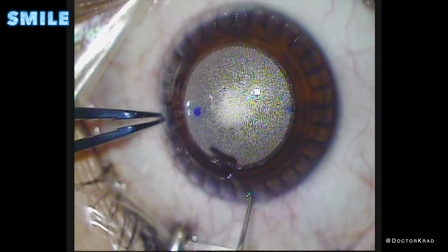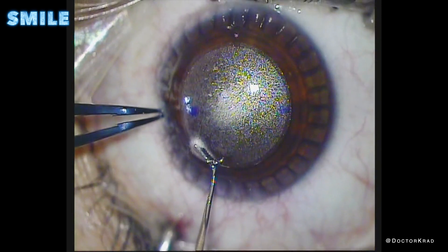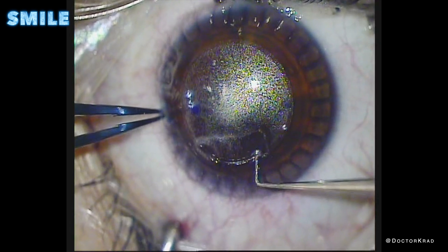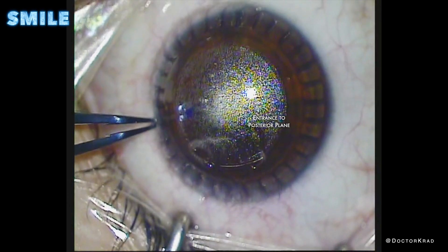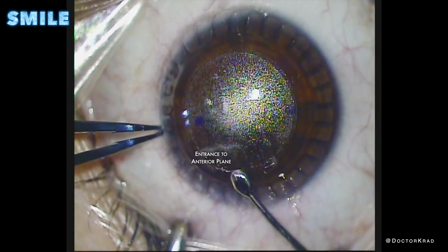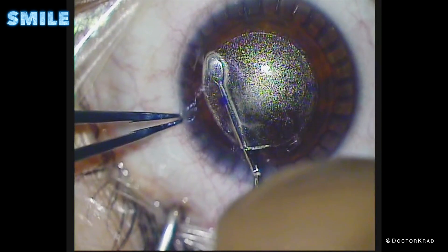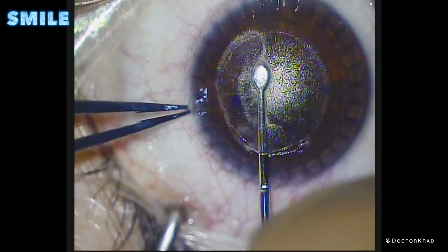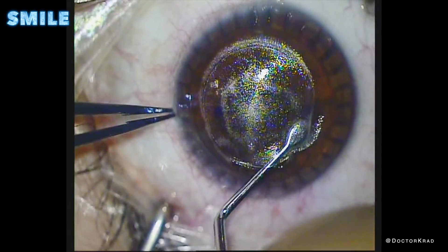During the dissection, it's very important to keep track of which plane you're in, either the top or anterior plane or the bottom deep posterior plane. So here I'm swiping across to create a plane in the anterior portion. And then on the right side, I create a pocket for the posterior portion. So now I know on the left side, if I enter the incision, I'll be on the anterior or front plane. And so I'm going to break all the little adhesions that remain after all those little air bubbles were created by the laser. I'm just going gently, carefully, going all the way across the anterior or top plane of the dissection.